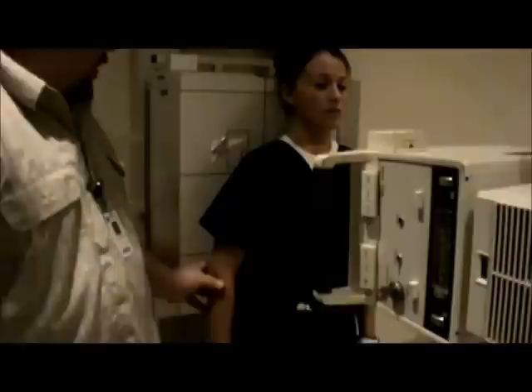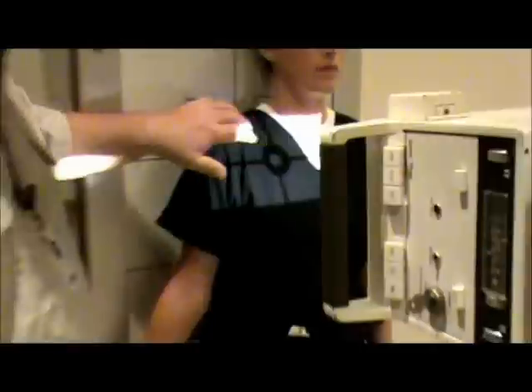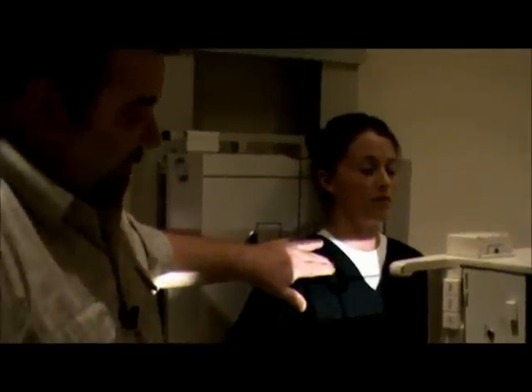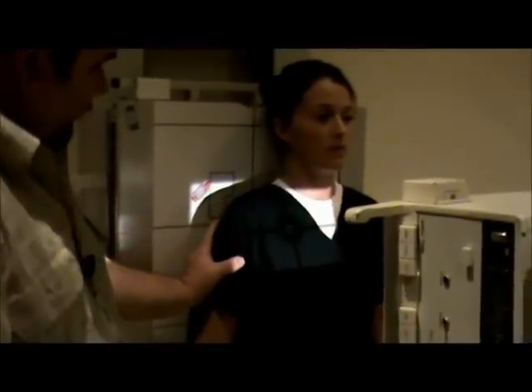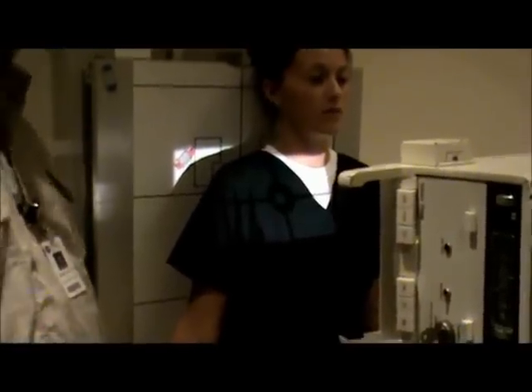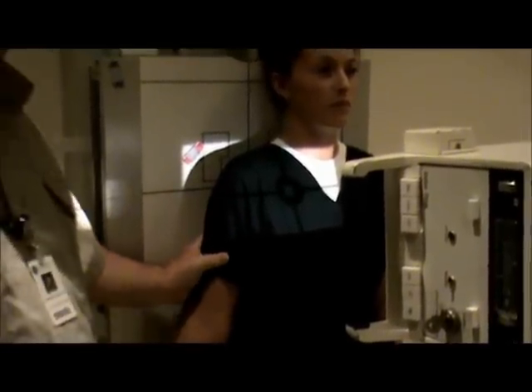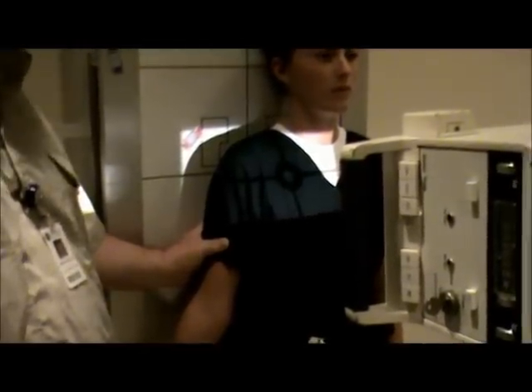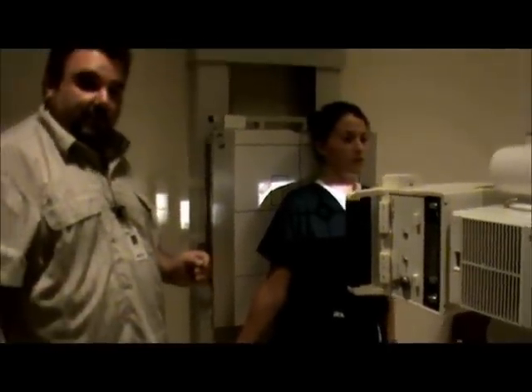Now we're going to go to our AP or external rotation of the arm. We're going to take the epicondyles and place them so that they are parallel to the IR. Our centering point remains the same — mid-clavicle, finding the bottom of the clavicle, one inch down from that. We're going to include all the way out to the shoulder to the SC joint. Technical factors remain the same: 77 to 81 kV, center cell, using automatic exposure control. What's visualized in the external rotation view is going to be the greater tubercle.